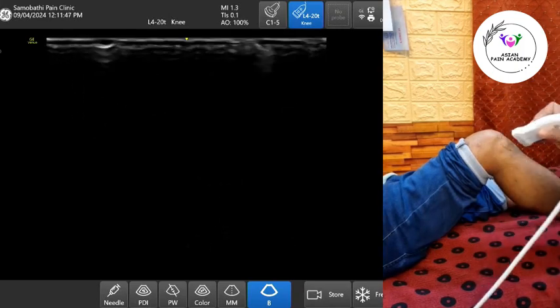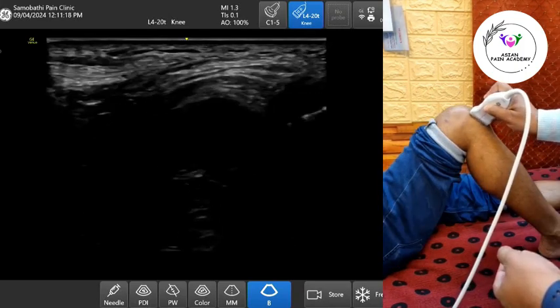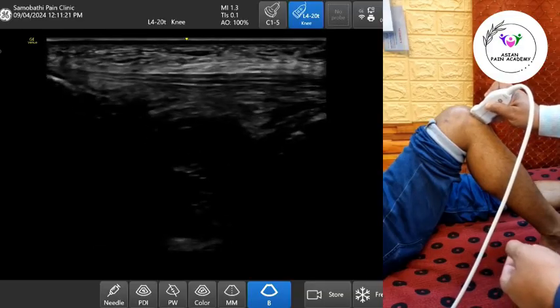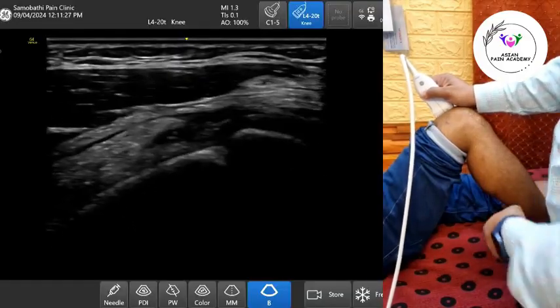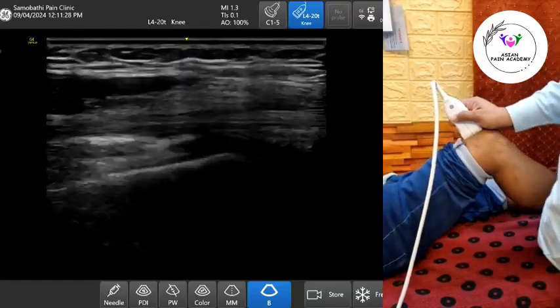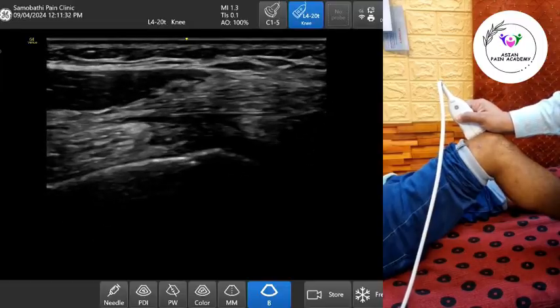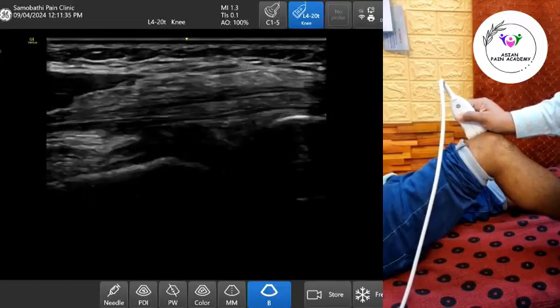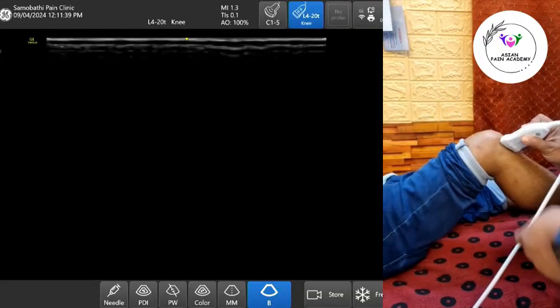In summary, accurate identification of deep infrapatellar bursitis requires patient positioning with slight flexion, high-resolution scanning in both longitudinal and transverse planes, careful inspection of lateral and medial recesses, and clinical correlation to confirm symptoms. Ultrasound not only helps in diagnosis, but also guides aspiration or steroid injection when needed.